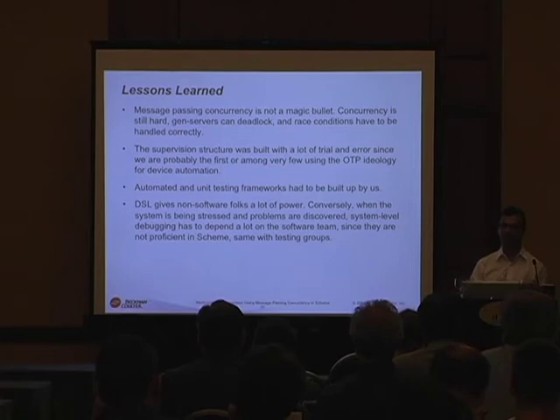The good thing is you have timeouts in your gen servers, and logging at higher supervisors, so that if at all something went wrong and something bad happened, even if it happens at a low frequency, it'll be caught correctly, you would have logged data, and you can debug it. The supervision structure was hard to build up, especially because as far as we know, we were breaking ground on this kind of stuff. There wasn't much to just go on the web and look at and say, oh, give us an example architecture for automating devices.